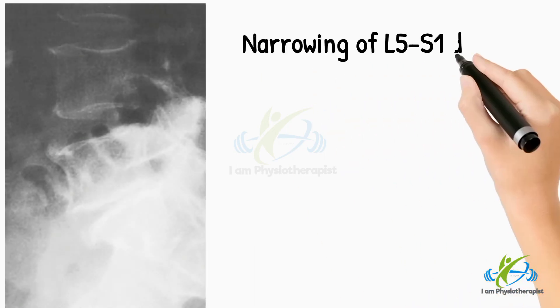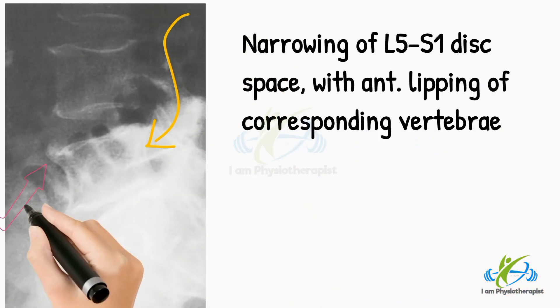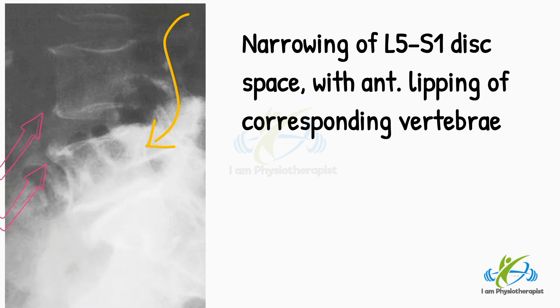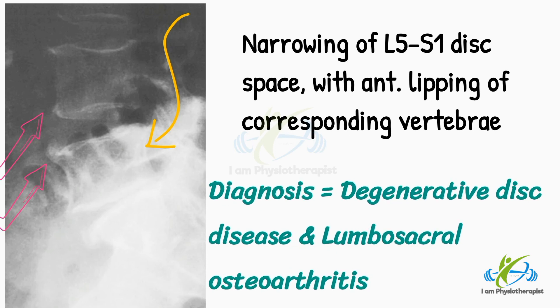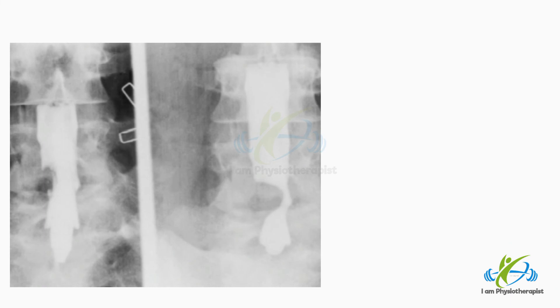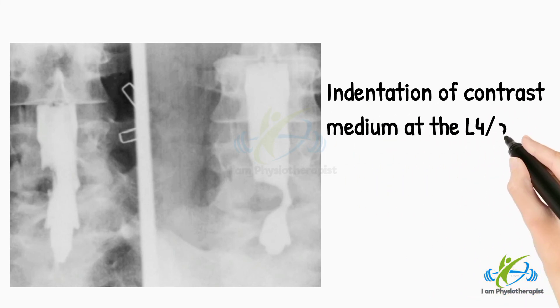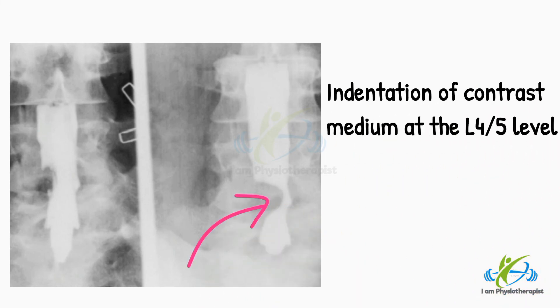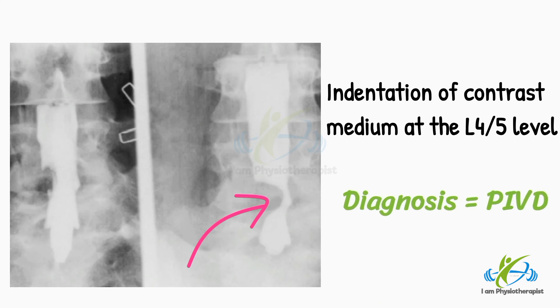In this radiograph, there is narrowing of the L5-S1 disc space with anterior lipping of the corresponding vertebrae. Diagnosis is typical appearance of degenerative disc disease and lumbosacral osteoarthritis. This myelogram of a patient complaining of back and right leg pain showed weakness of dorsiflexion and eversion of the right foot and sensory impairment over the lateral aspect of the calf. The myelogram shows a well-defined indentation of the contrast medium at the L4-5 level. Diagnosis is prolapsed intervertebral disc.